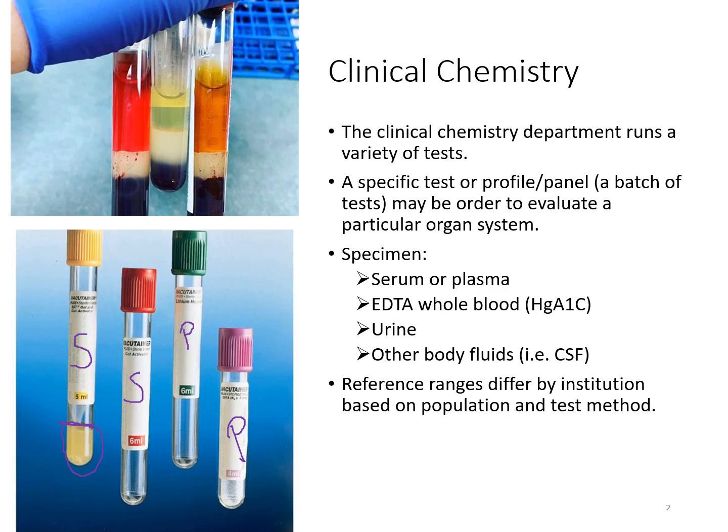If you look at these samples up top, this first one here, which is kind of a cherry red color, is hemolyzed. Those red cells, for whatever reason, have ruptured and caused hemolysis. The hemoglobin that was inside of those red blood cells leached out and caused that cherry red color. And then this one here to the side, this tube would be considered icteric.